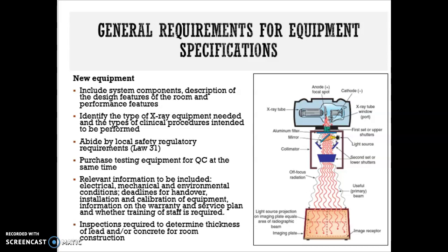Testing equipment required to perform daily to monthly quality control procedures must be purchased at the same time as the X-ray unit. Any electrical, mechanical, and environmental conditions which may affect the performance of the equipment should also be included.